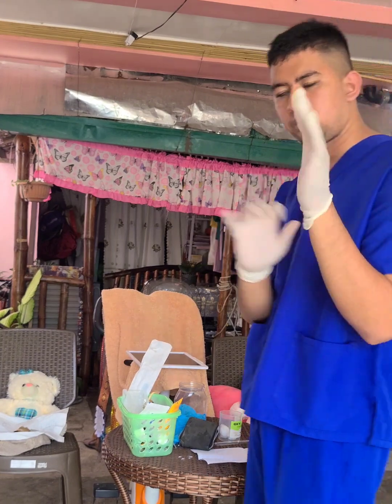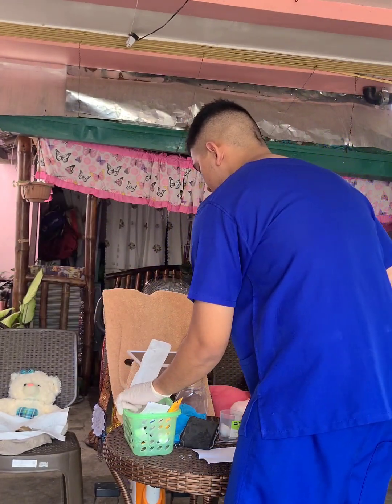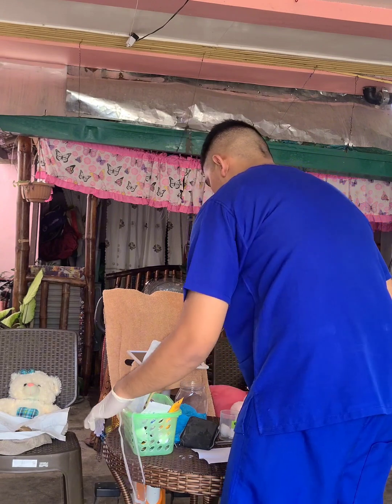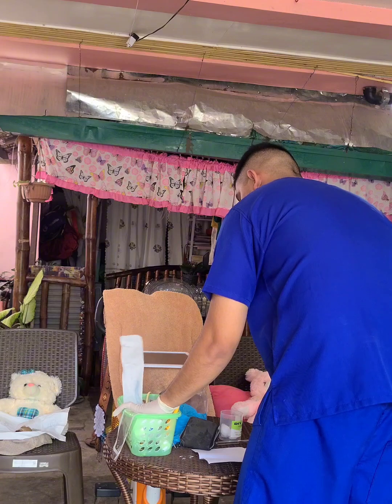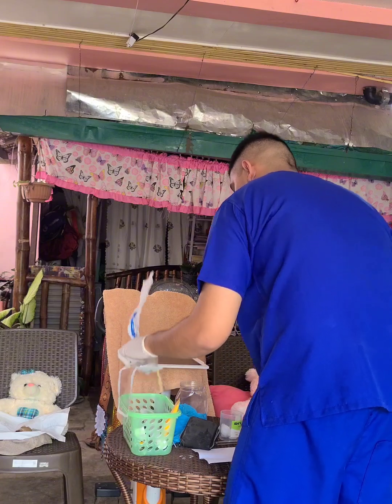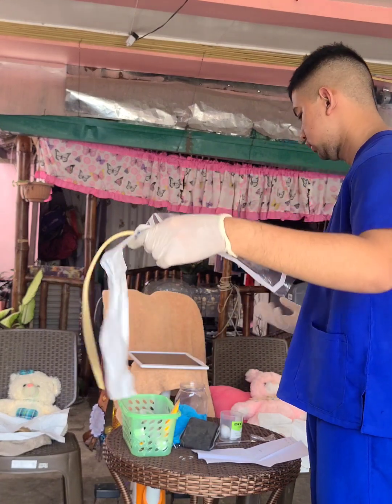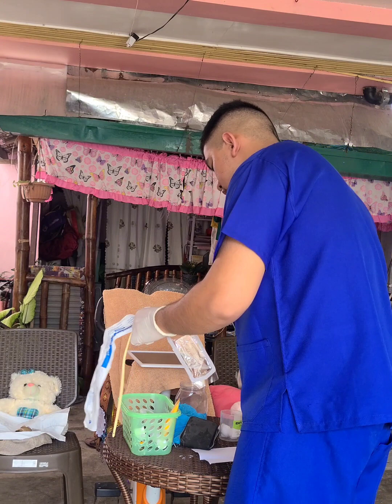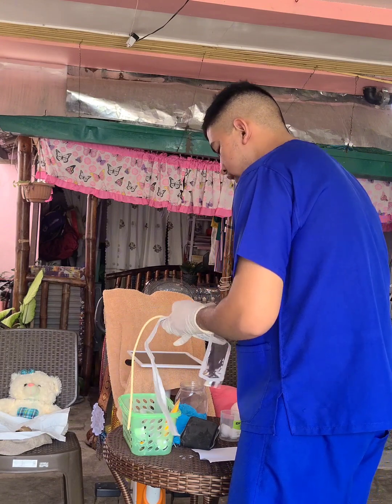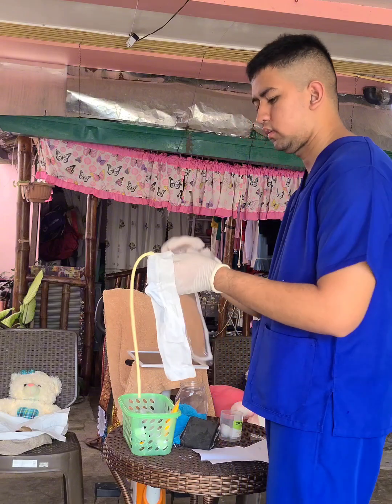So now we've put on our gloves, we're going to unseal the catheter without touching it at first, the packaging. Then we're going to put on the syringe with our dominant hand, which is the sterile part.